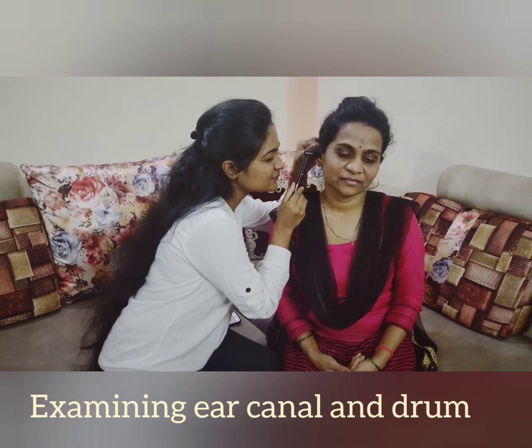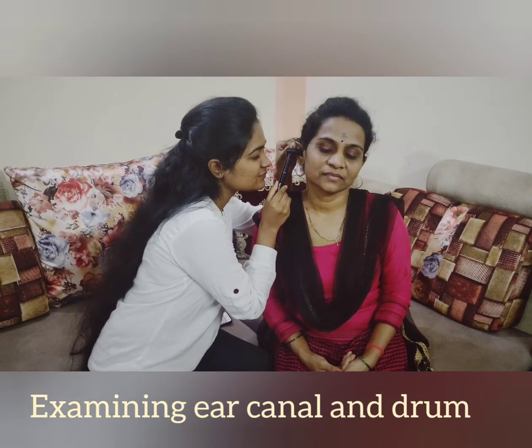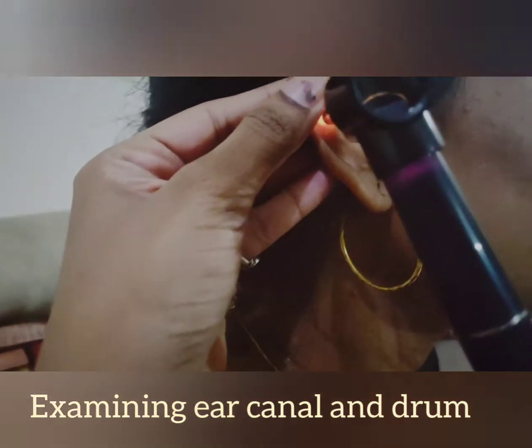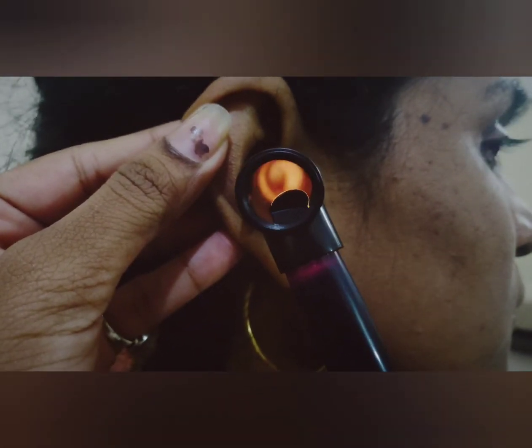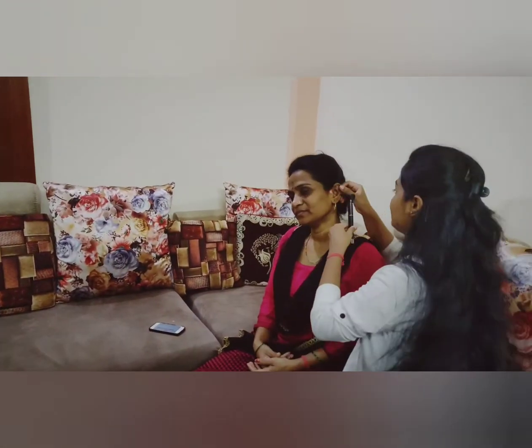To straighten the ear canal, grasp the auricle firmly but gently and pull it upward, backward and slightly away from the head. Insert the speculum gently into the ear canal, directing it somewhat down and forward through the hairs if any. Be sure to examine the other ear in the same manner.